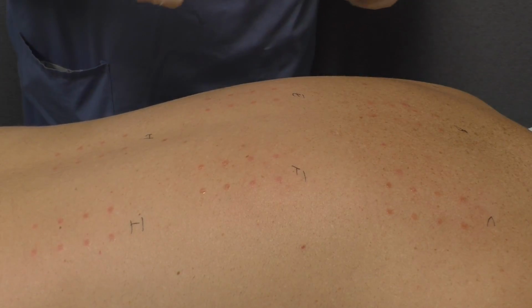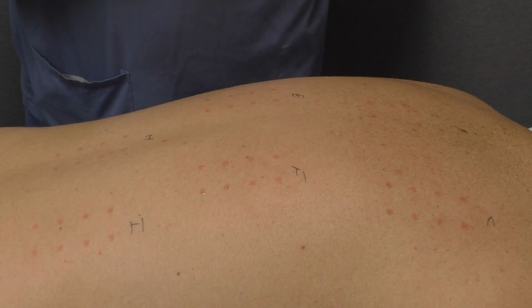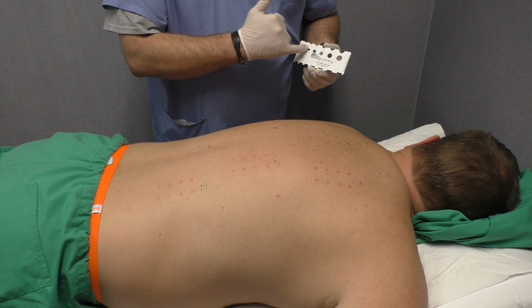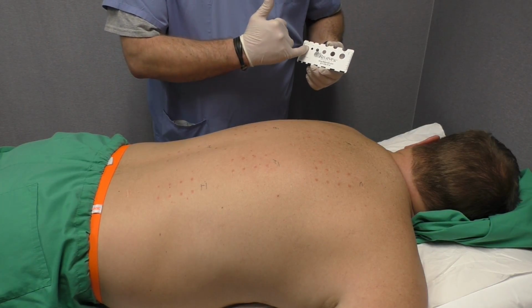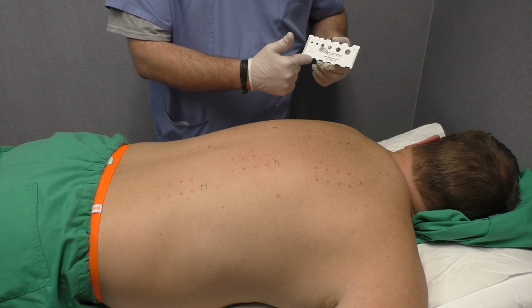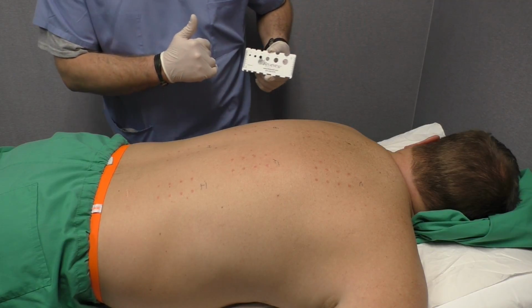We then use our ruler to take our measurements. The ruler has a lot of different ways to measure. You have the half circles at the very top. They go from 4 millimeters, 5, 7, 9, 11, and 13. The full circles are the same measurements as are in between the bolded lines. And then along the edges are your individual millimeter increments.